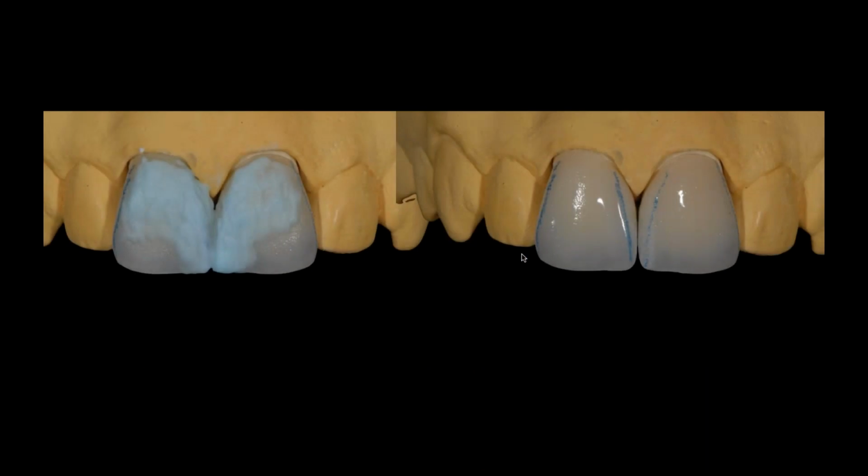When I fired them, I felt the one was a little weak, so I actually went back and did a little tiny correction bake with a little bit more enamel just to finalize the contour. So I'll do that sometimes. Sometimes I get it perfect in the first bake. It really depends, but you get the idea.